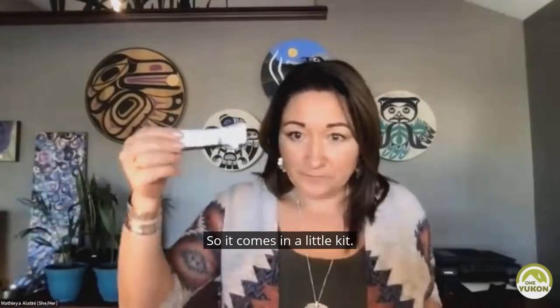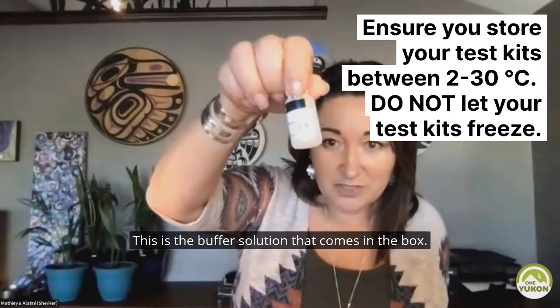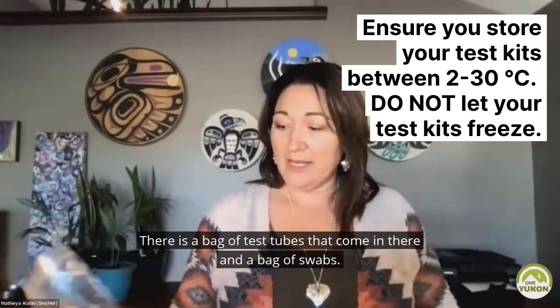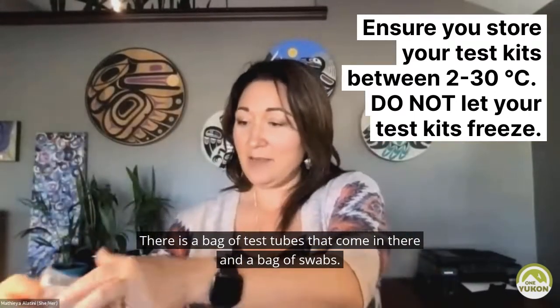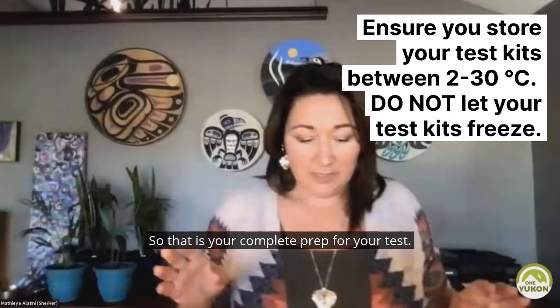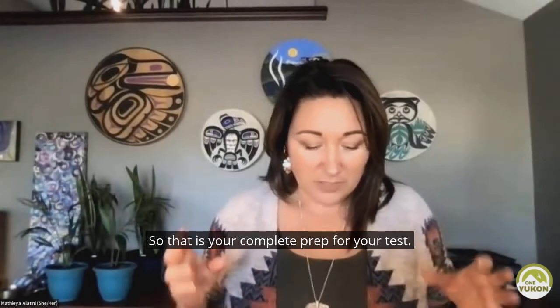So it comes in a little kit. This is the actual test. This is the buffer solution that comes in the box. There is a bag of test tubes that come in there and a bag of swabs. So that is your complete prep for your test.